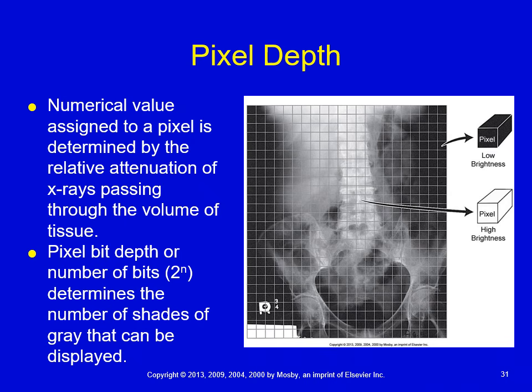Now in telemedicine, if I was trying to send these images from one location to another, one hospital to another hospital, that means that the transmission time, as these files get larger and larger, can be slowed down as a result of the information it needs to send. Just like when you send files, some files transfer really quickly and get to the person really quick, and then some files, based on how much information you had in the email, may take a little bit longer to get to the person because of the transmission speed.